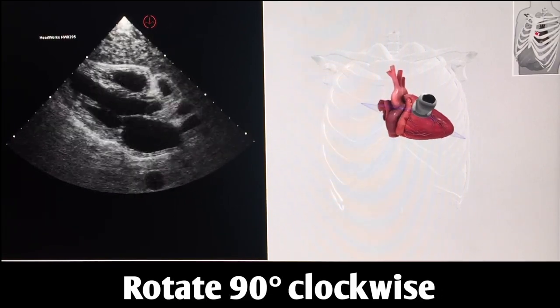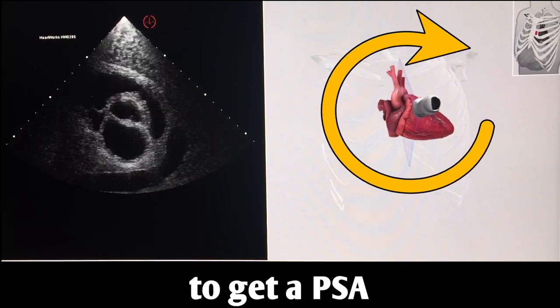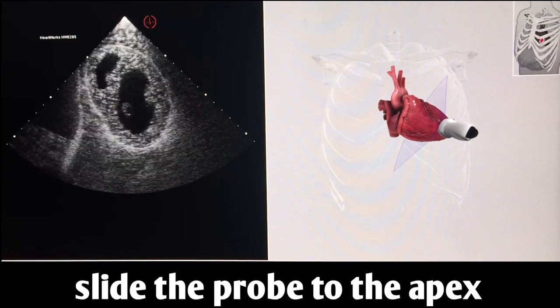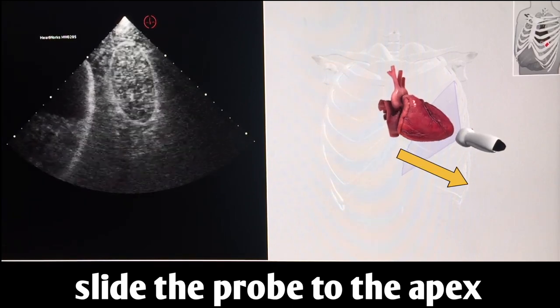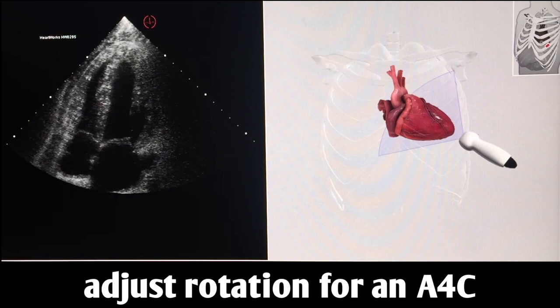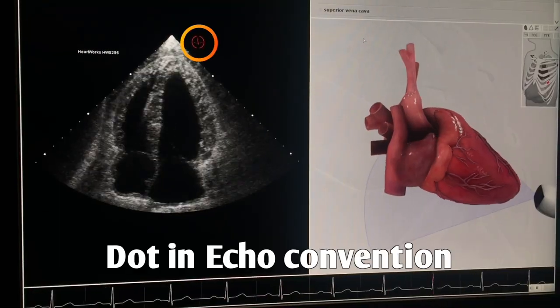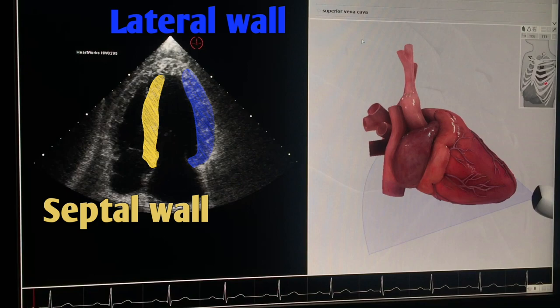From the parasternal long-axis view, rotate the probe 90 degrees clockwise to achieve a parasternal short-axis view. From this view, slide the probe along the long-axis of the heart towards the apex. Once at the apex, fan the probe towards the base of the heart to gain an apical four-chamber view. In this view, you'll be able to measure the septal and lateral wall's mitral annular velocities.